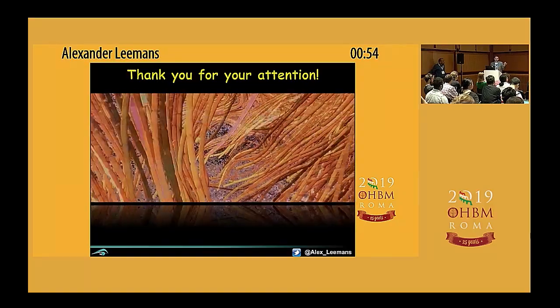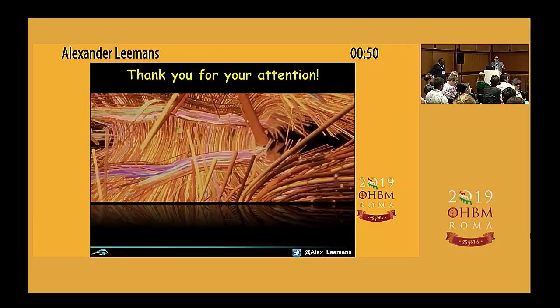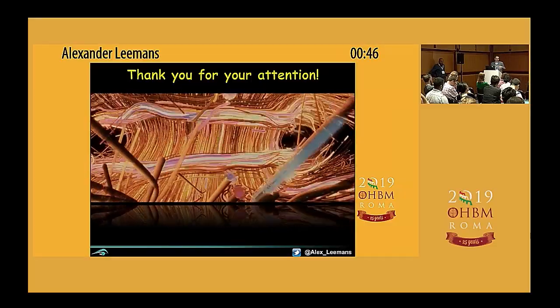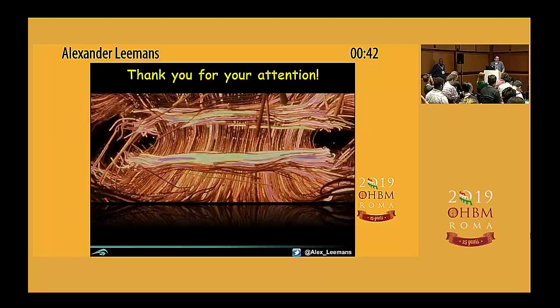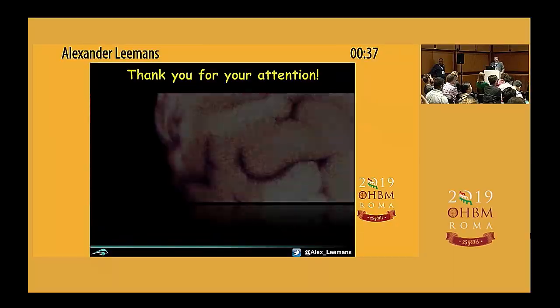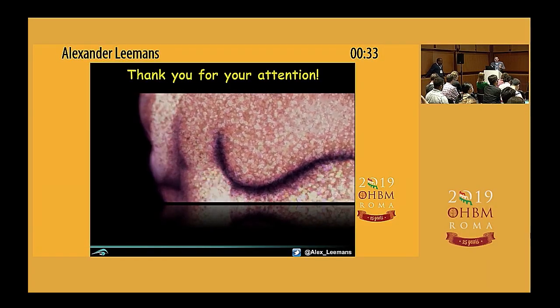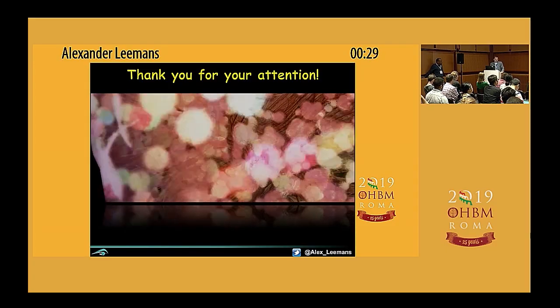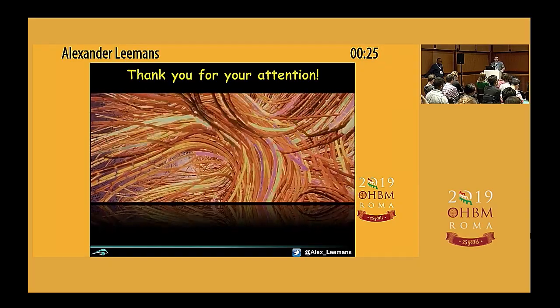And then, there's always subject motion, especially nowadays, because our diffusion acquisitions can tend to be a bit longer, because we acquire more data, especially in neuroimaging dedicated centers. There's always slight residual eddy currents, because even with twice-refocused gradients there's always a bit of stretching or skews. The EPI distortions become more pronounced at higher field strength, so we also include that.